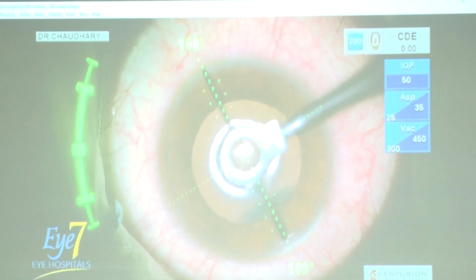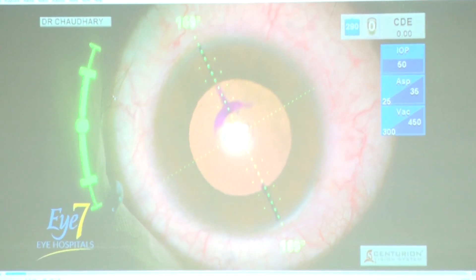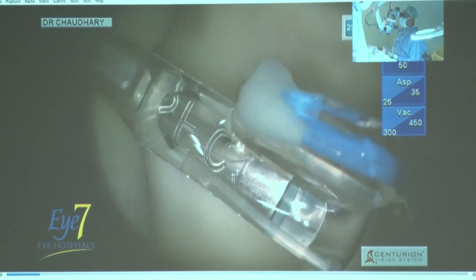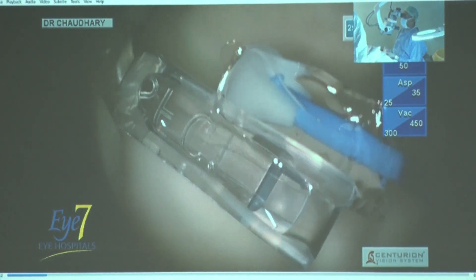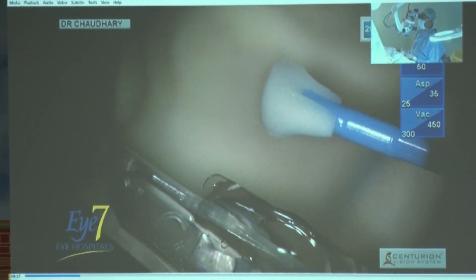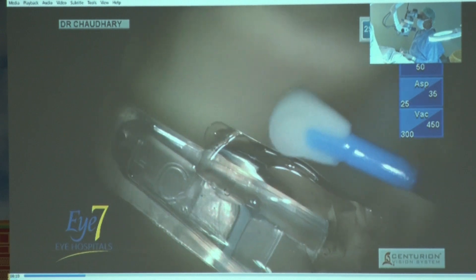The axis of placement of the lens is very important if you're using a toric lens. Of course you can use a slit lamp, but some fortunate people have the digital marking system. I use the digital marking system, and then the loading of the lens.